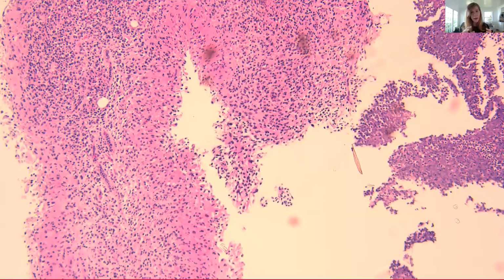Now that's pathognomonic for granulomas. So when you see epithelioid histiocytes, that is granulomatous inflammation. As we know, granulomatous inflammation can be due to many different things: infectious, foreign bodies, sarcoidosis, other things. And so what we try to figure out is what's causing the granulomatous inflammation. And in this slide, you can see these little empty round spaces, and those are spaces where lipid used to be.